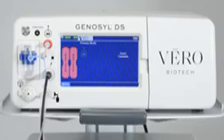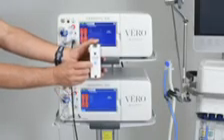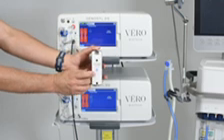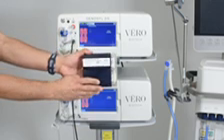You will need 2 cassettes for the dosing console and at least 1 for the backup console. Confirm the cassette state window on each cassette is blue and the plastic perforation below the cassette state window has not been punctured. Check the expiration date for each cassette to ensure it is not expired.